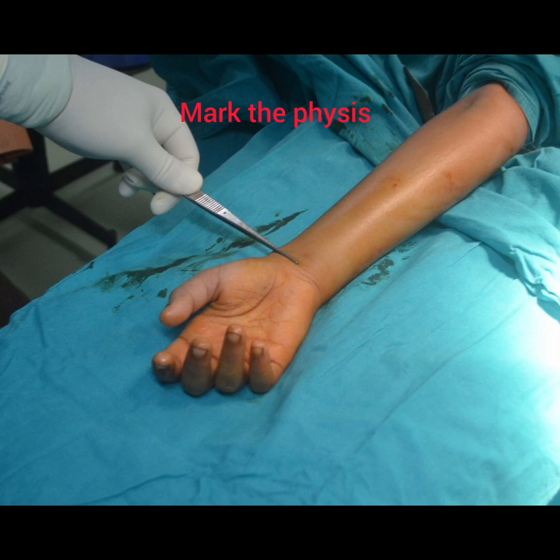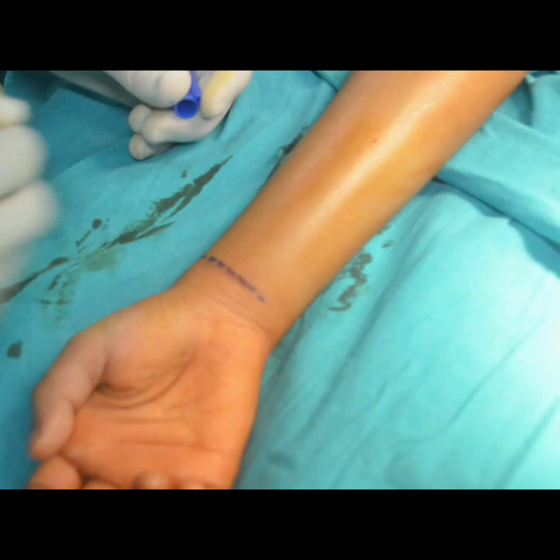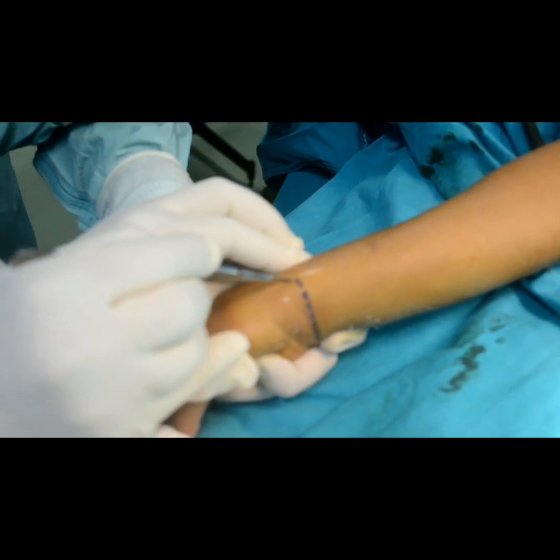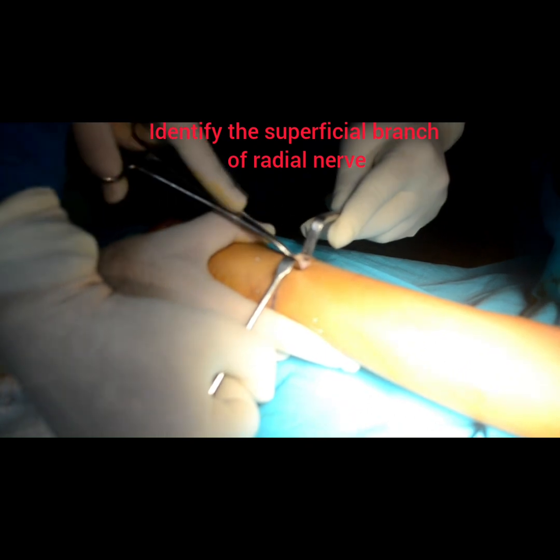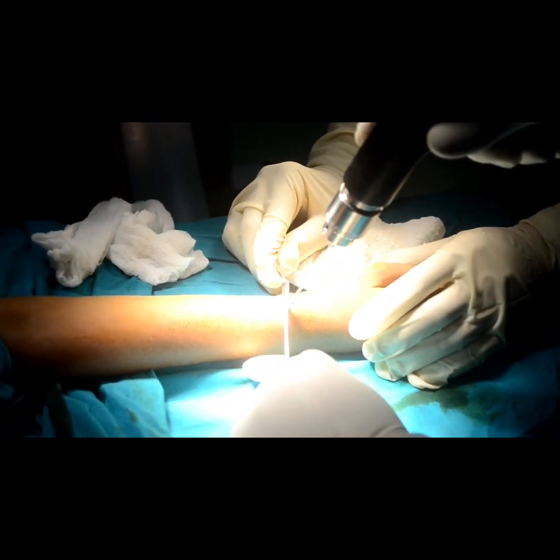The next step is to mark the physis for the entry of the radius nail. We are going to take an incision between the first and the second compartment. Try to identify and preserve the superficial branch of the radial nerve. Make a small hole using a K wire.